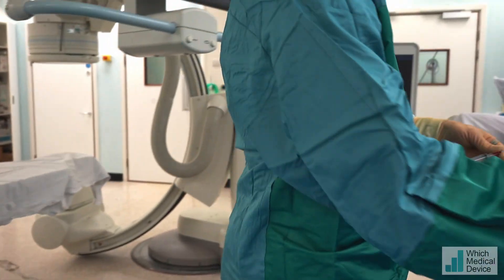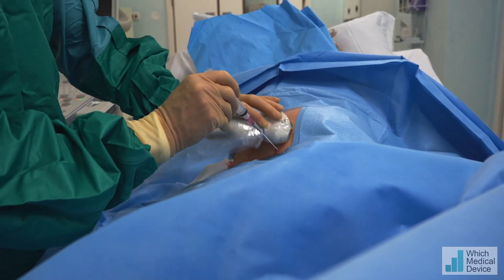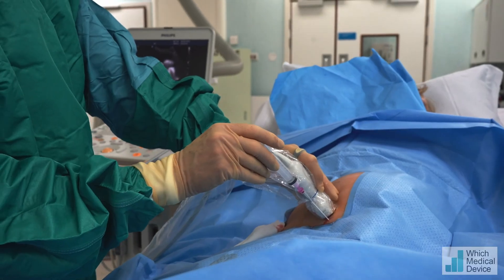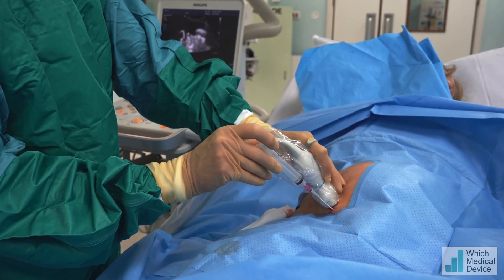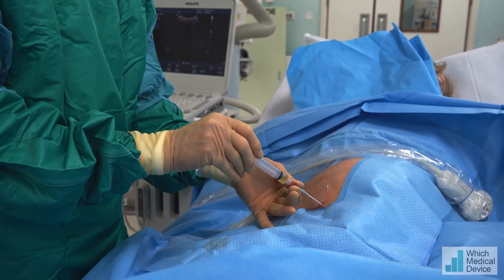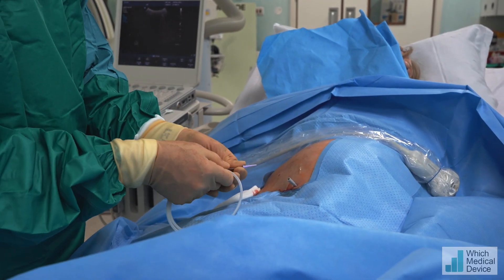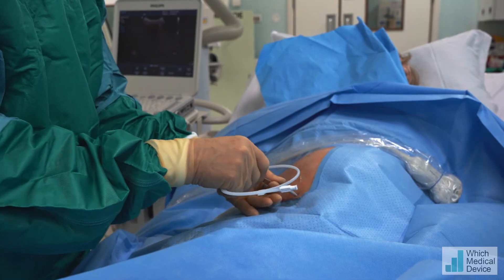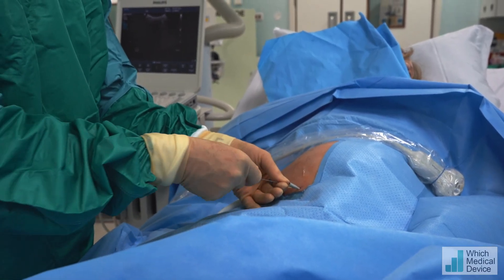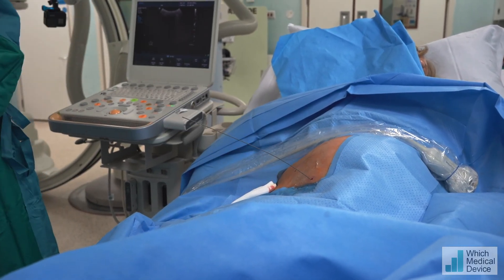I'm just going to take my guidewire and have that handy. We can just check with ultrasound before we do this — check we're absolutely happy with that position; we can actually see it on the ultrasound. I'm keeping this as a very steep puncture. A bit of pushing now — okay, and that's us through into the peritoneal cavity. We've got fluid coming back, so we can slide that sheath forward. I'm going to advance this J guidewire in — this might tickle a little bit inside; it can irritate your bladder sometimes. Making sure we've got plenty of wire in there, coiled up within the peritoneum, we can then take that out and leave the wire.